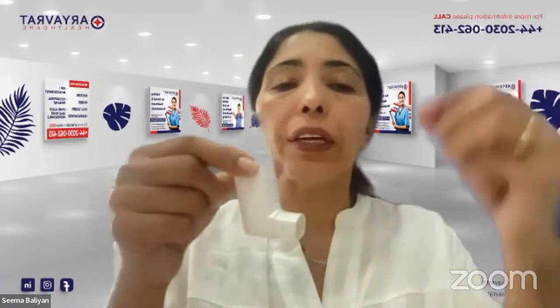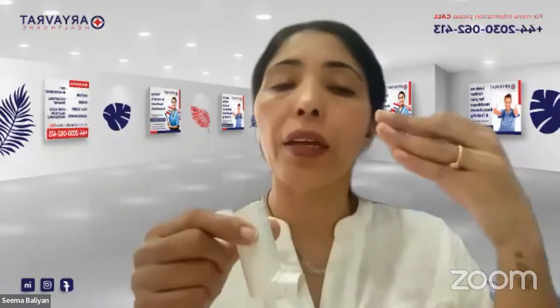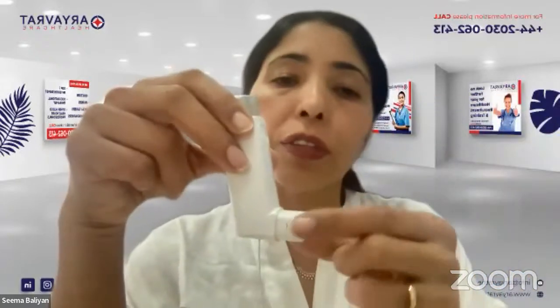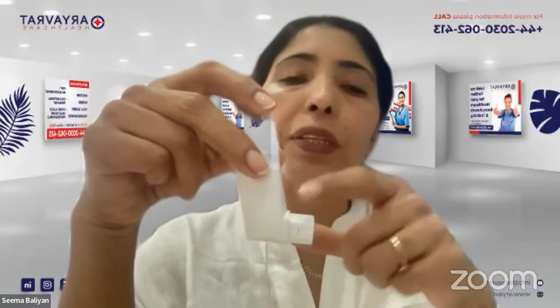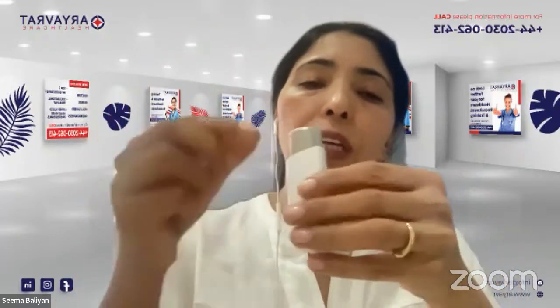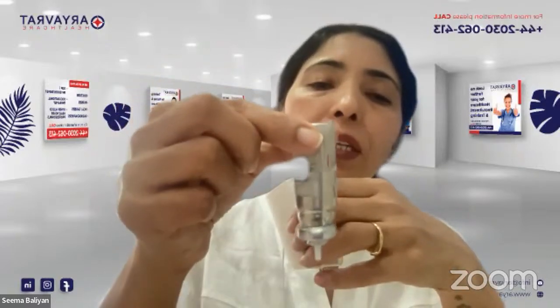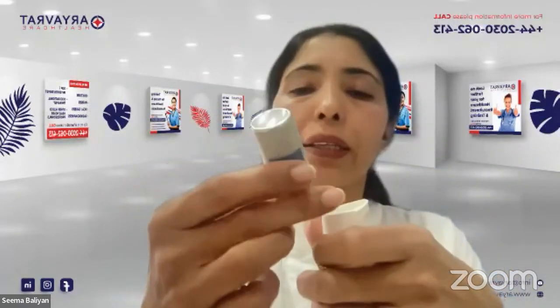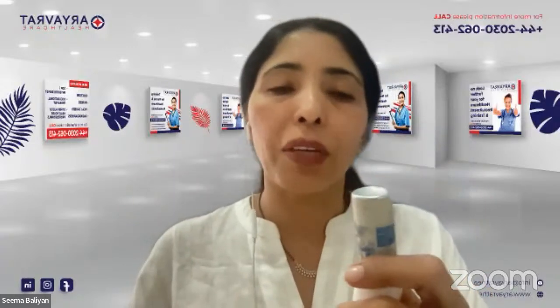So now we know what an inhaler is, and we know why we use the inhaler. Now the third thing we come to is the parts of the inhaler. In the parts of the inhaler, you will see that this is the mouthpiece. Usually there is a lid as well, which will be covering the mouthpiece, but this is the mouthpiece and this is the body of the inhaler. In the body of the inhaler, you will find the medicine canister. So this is basically what a medicine canister looks like. Now, when you are in the exam and checking the medicine canister, it is better that you check your chart at the same time.